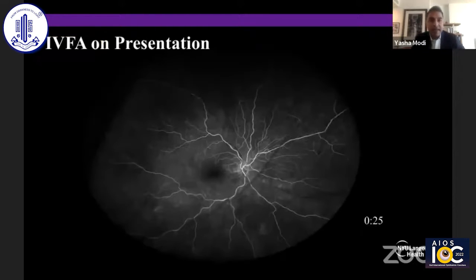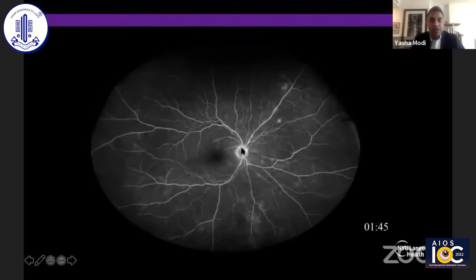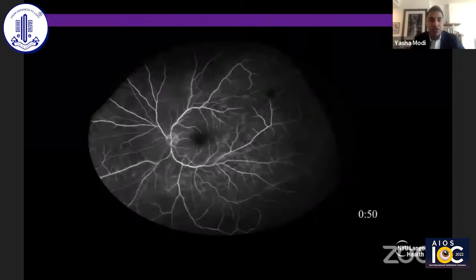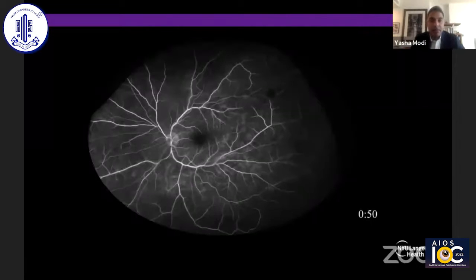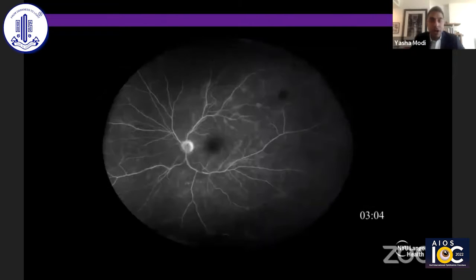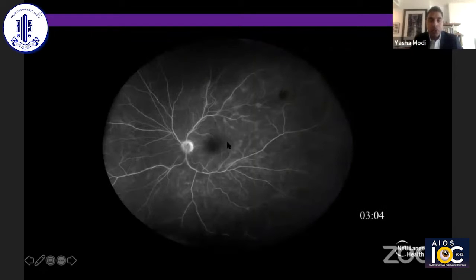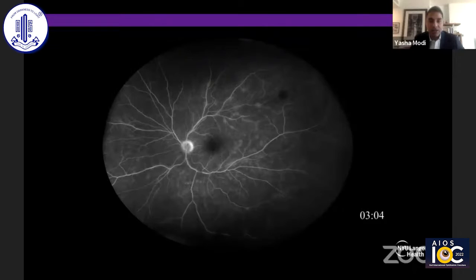This is her FA on presentation — this is the right eye. As we move on, we can see some mild disc leakage and focal areas of fluorescence in the periphery corresponding to staining as well as leakage. In the left eye, about 45 seconds in, we start to see a perivenular pattern of leakage as well as some disc leakage. Notably, there is an absence of leakage or pooling in the macula where we saw that splitting of the IZ and the RPE.